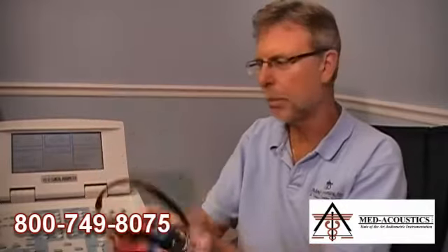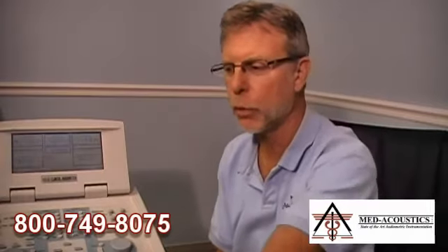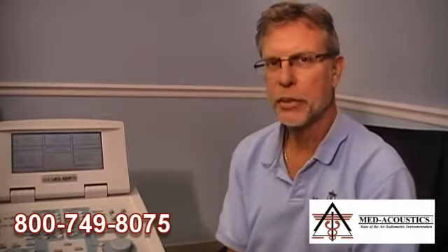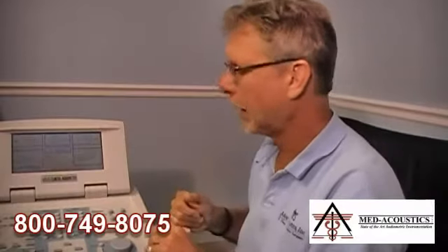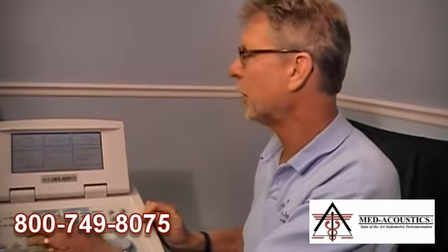Every audiometer has a set number of transducers that deliver signals to patients. There is a standard set of headphones, a bone vibrator, insert earphones, and sound field speakers. That gives us seven transducers total — two phones, two inserts, two speakers, and one bone vibrator. We want to be able to listen to each one to make sure there is a signal present, that the signal is consistent and doesn't cut in and out, and that it is at the proper level.